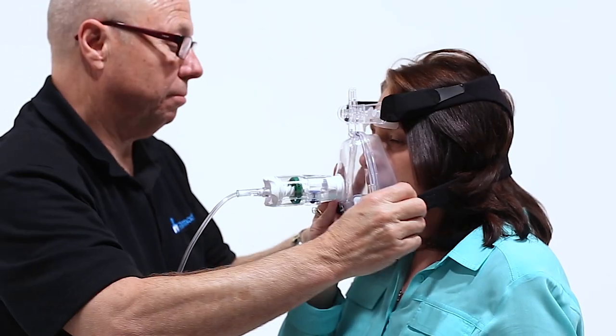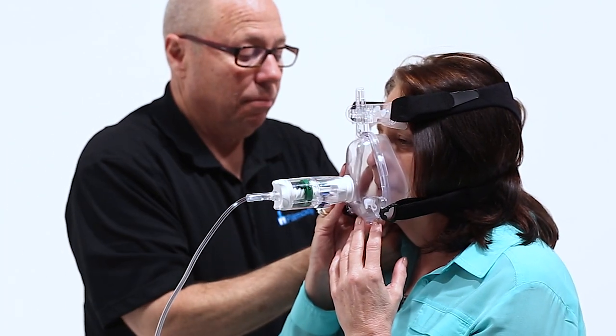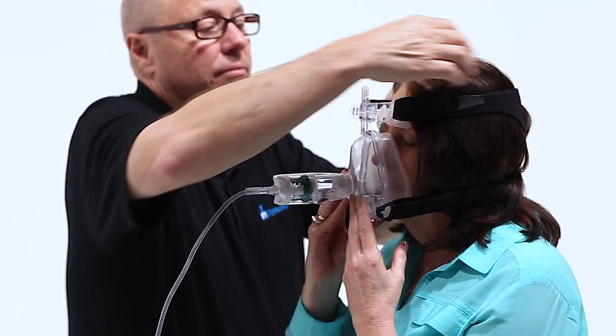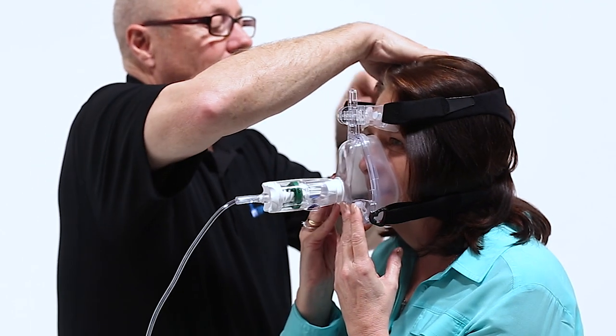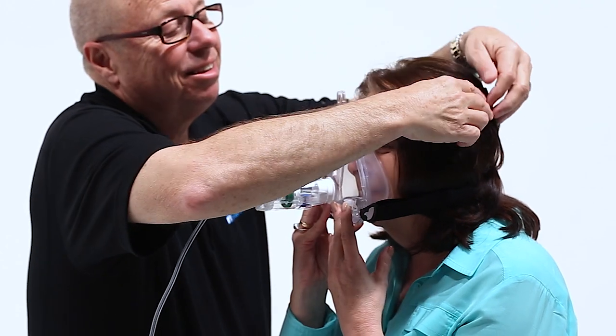Do not tighten the mask too tightly. Tightening the mask too tightly could create leaks around the patient's face. Our mask is a floating mask and it is created to float on the patient's face comfortably to create an efficient seal.